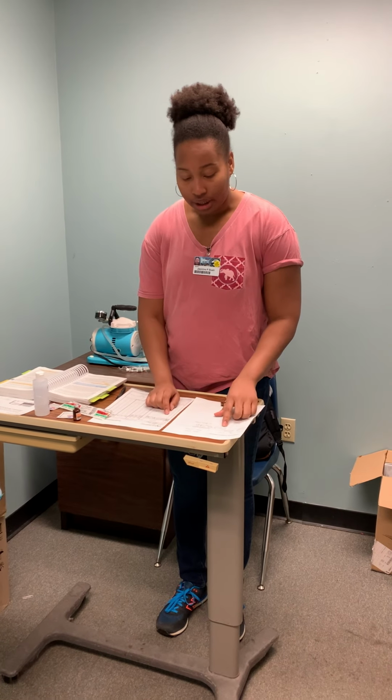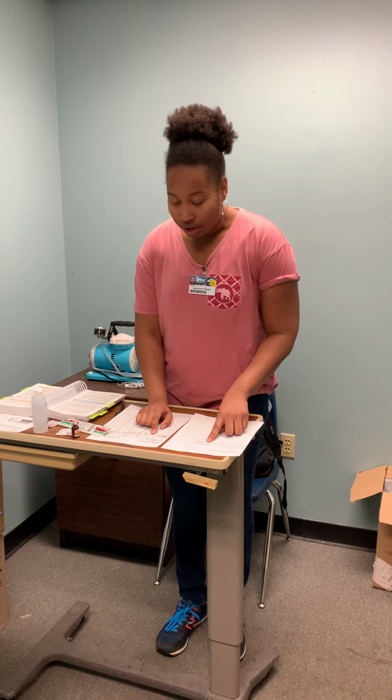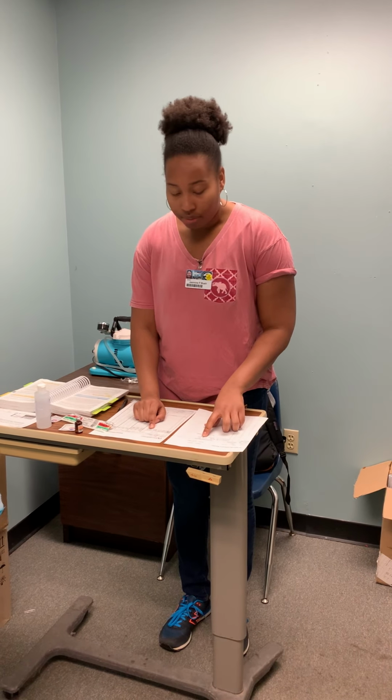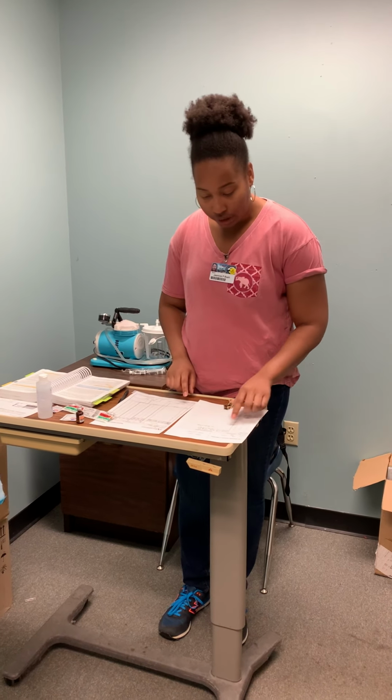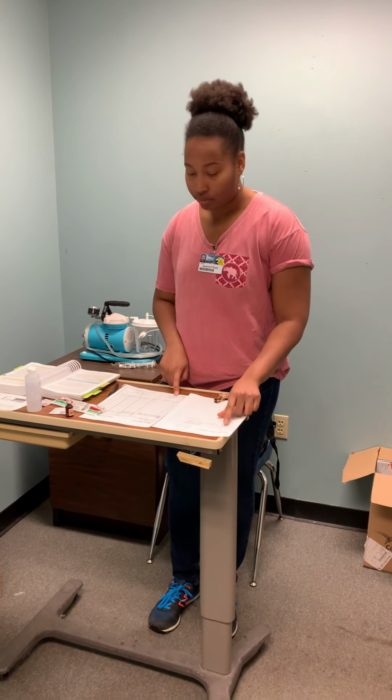I'll be checking the medication, furosemide, the dosage, 30 milligrams, the route, IV push, and the time, every 8 hours. And I will be checking for allergies, and she does have an allergy to penicillin.